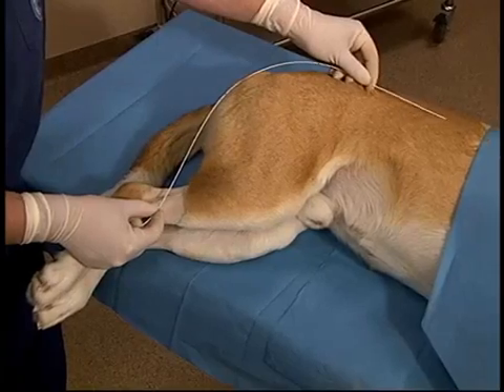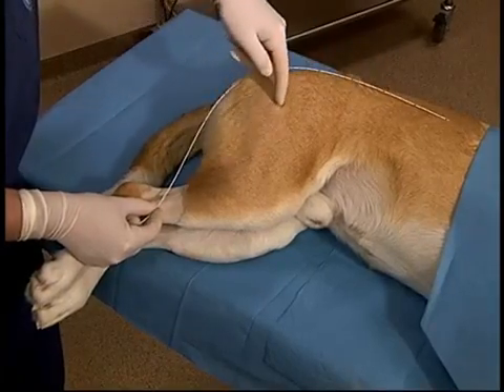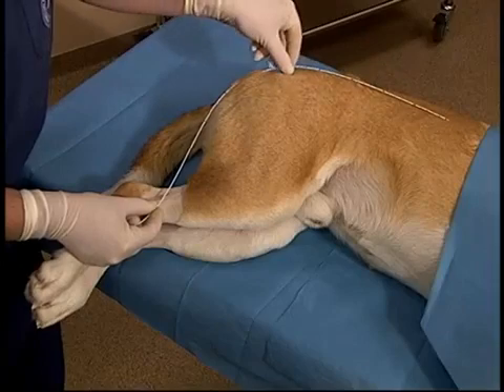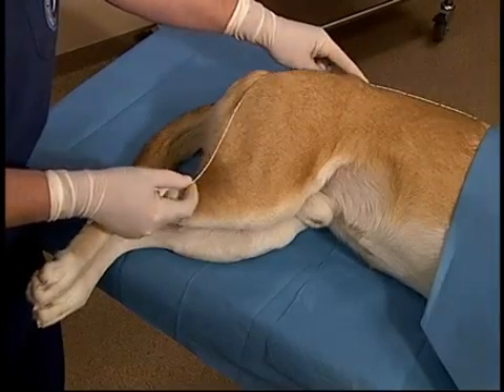They should be pre-measured to the desired location. It should be kept in mind that the vessel does not actually follow the superficial location, but actually drops medially to join into the vena cava, and when pre-measuring this should be taken into account by dropping the catheter over the back of the animal.